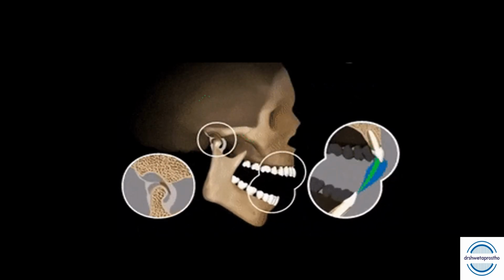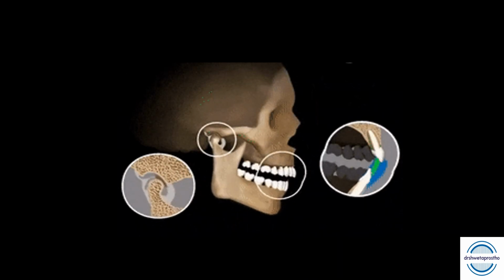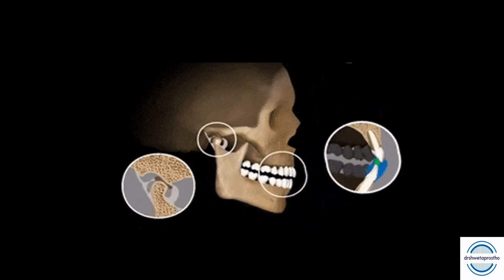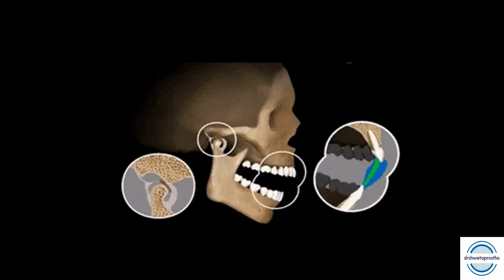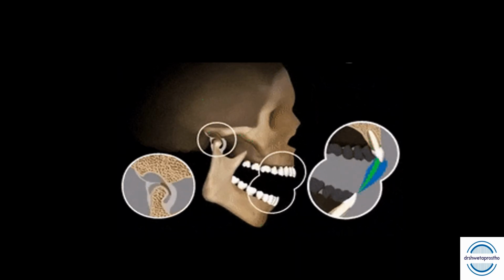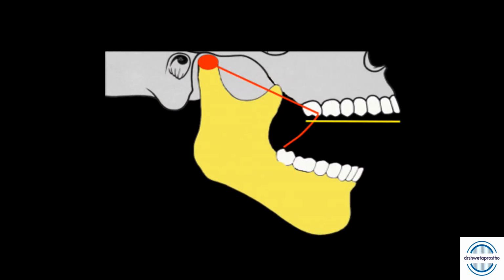Now, before going to the topic, we all know that the movements of the teeth are the result of the rotation and sliding made by the condyles. For fabrication of any indirect prosthesis, indirect restoration like crowns, bridges, full mouth cases or making complete dentures, two things we need to duplicate in the articulator. First is the distance from the condyles to the teeth or the jaws, and second is the arc of closure of the mandible. This will reduce the potential of occlusal errors in the final prosthesis.